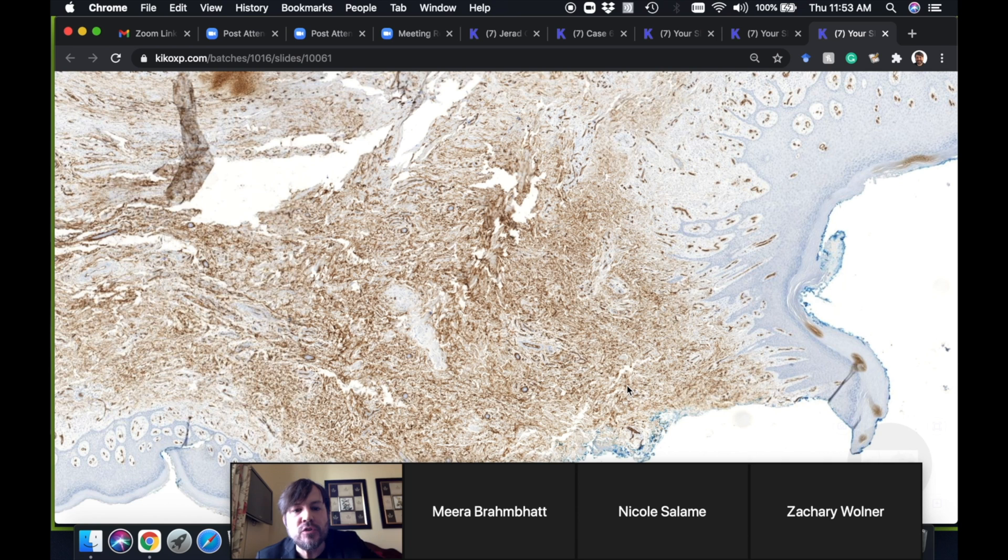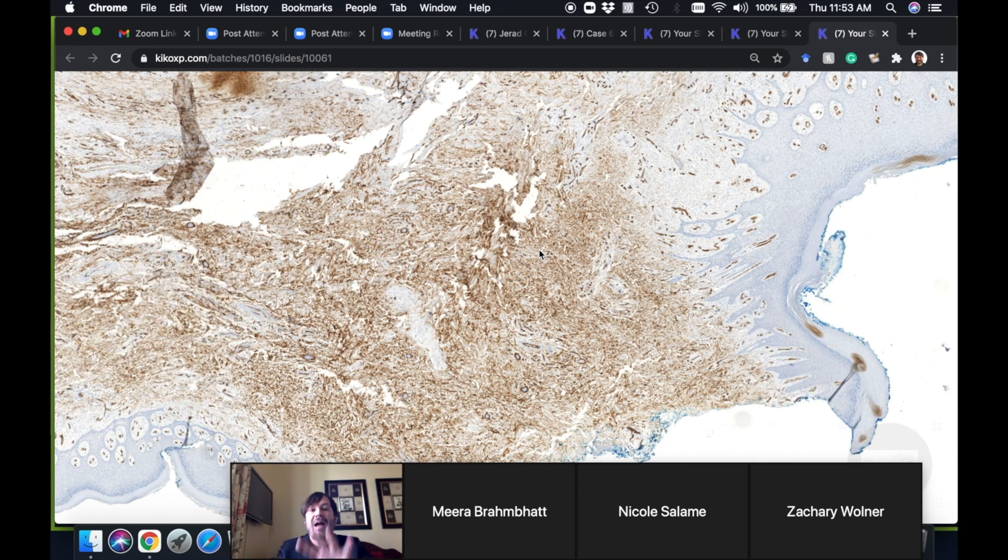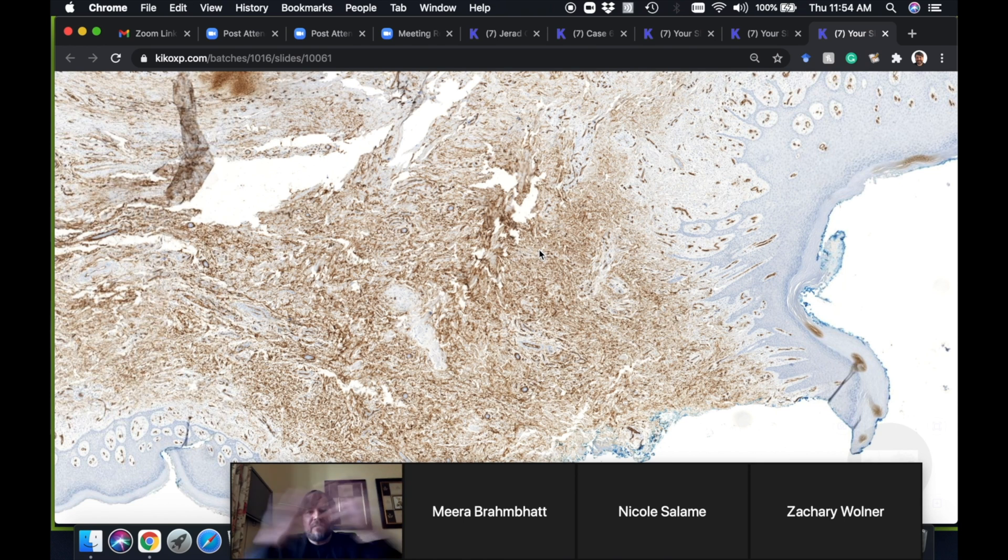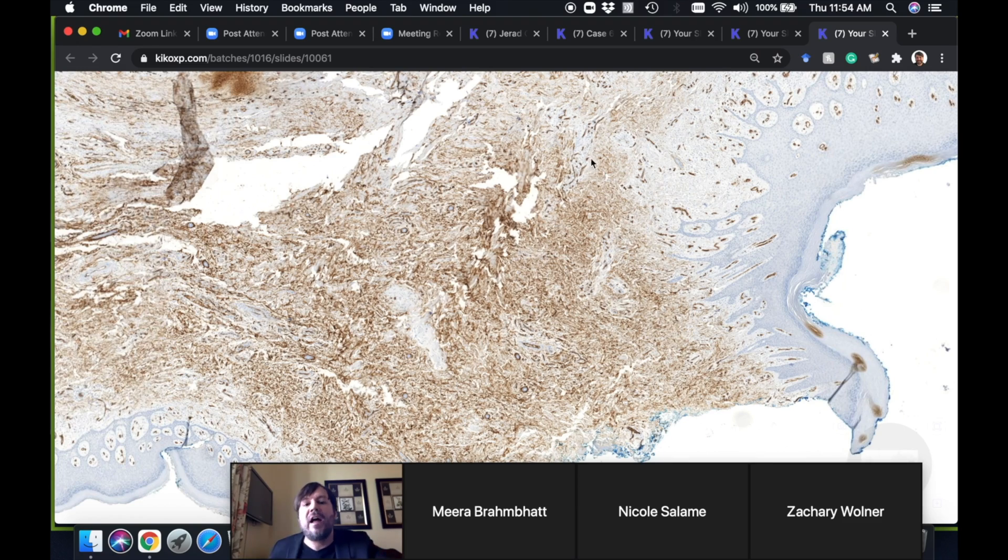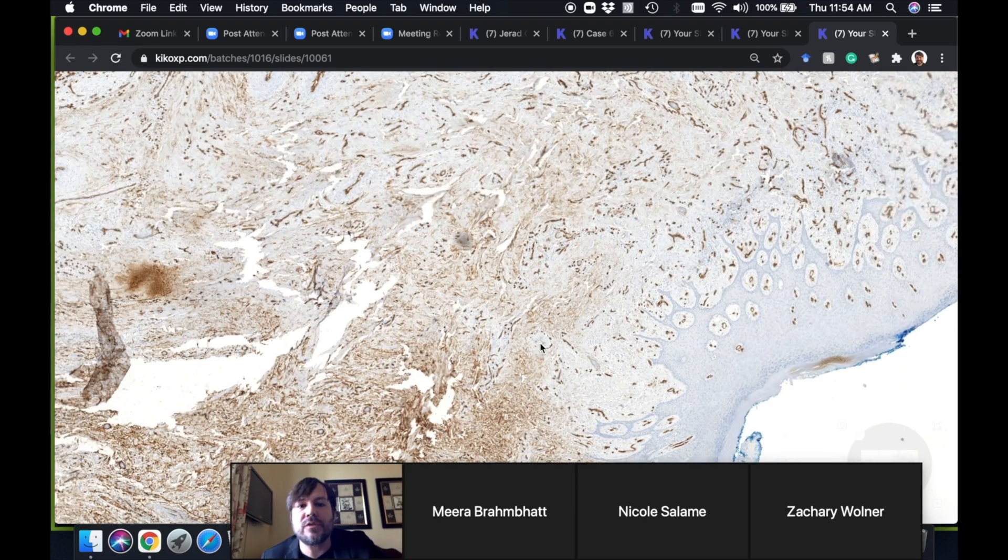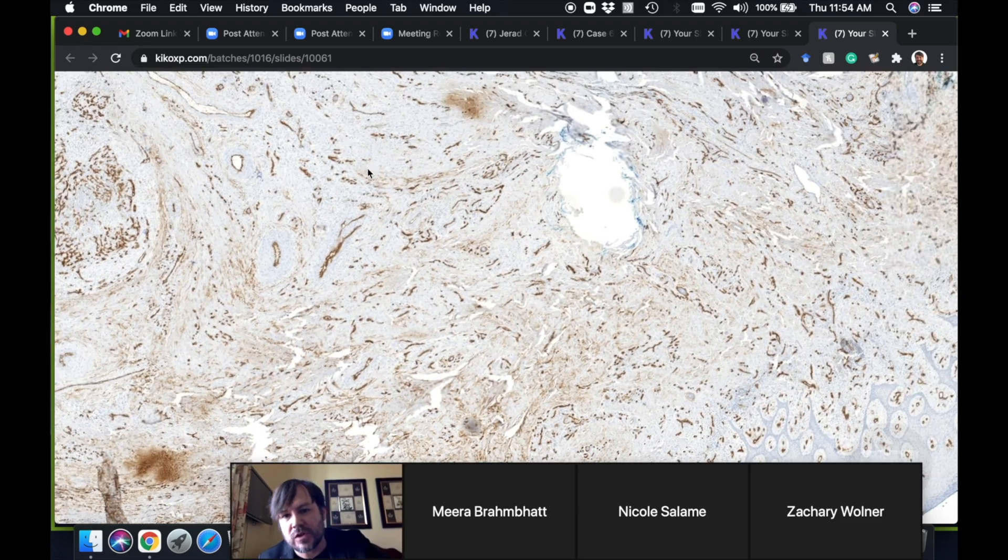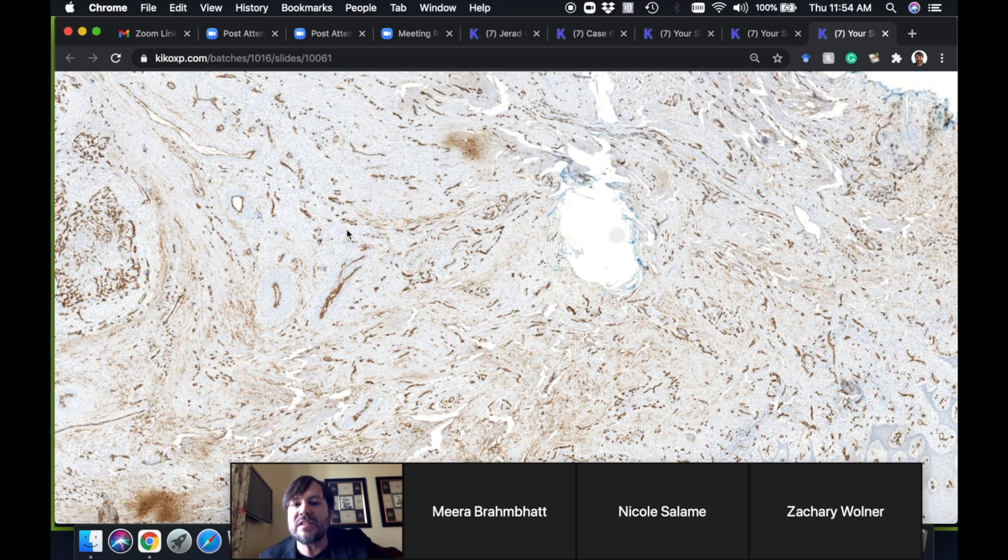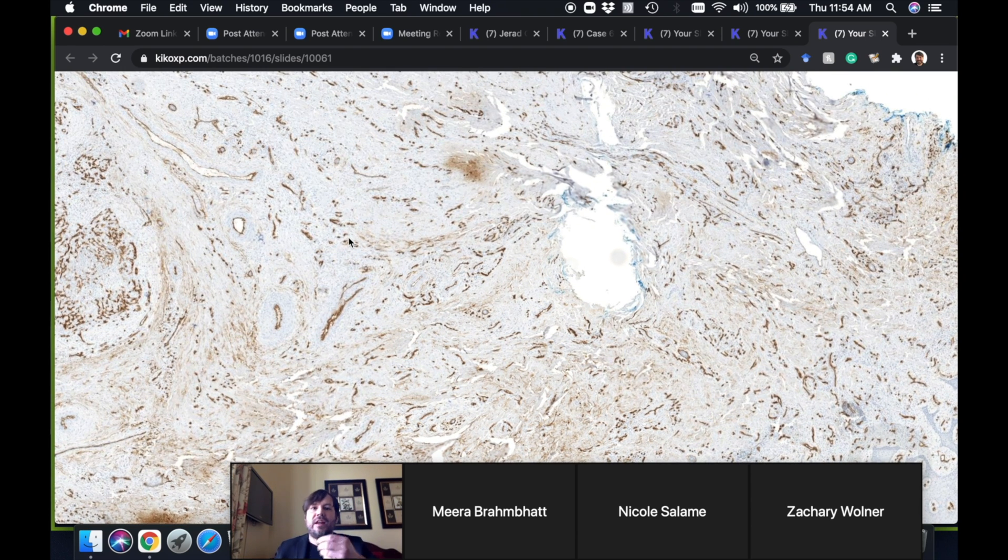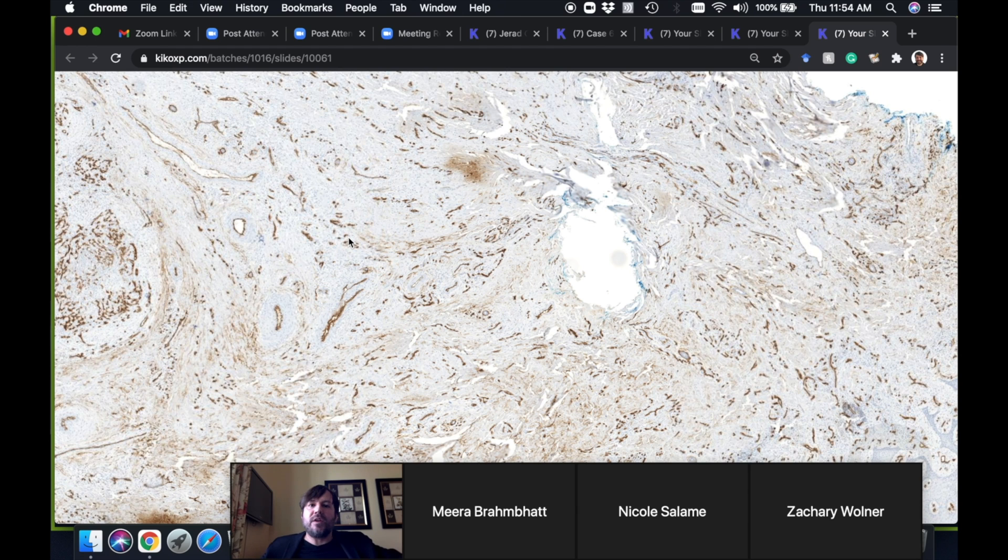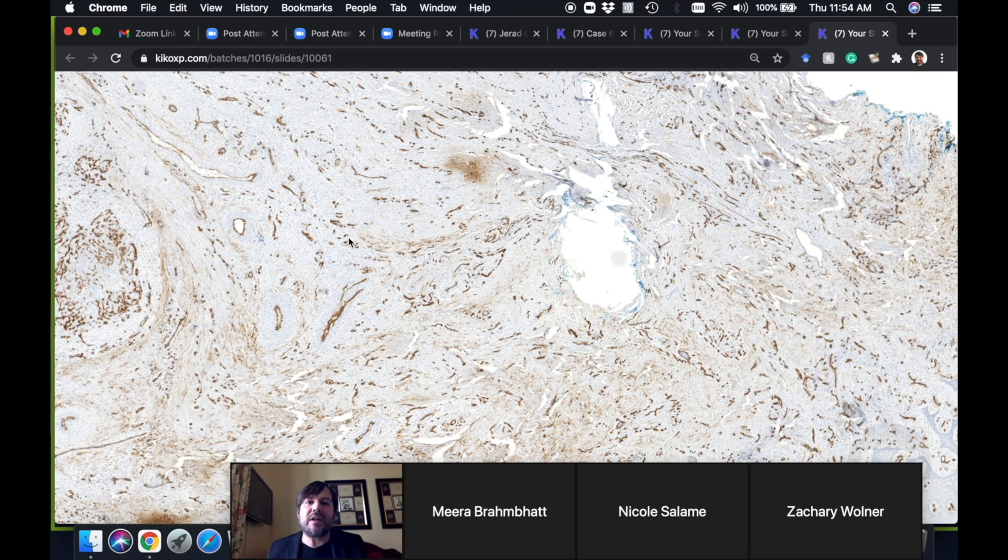Yeah, the normal dermis stains strongly with CD34. That's why it's helpful in DF, because the background dermis will be positive—it'll be brighter at the edge of the DF, and in the middle of the DF it's wiped out. The same is true often in scar. A lot of this stuff here is probably scar tissue kind of growing around, because in scar tissue you're getting granulation tissue comes in and replaces what used to be dermis.